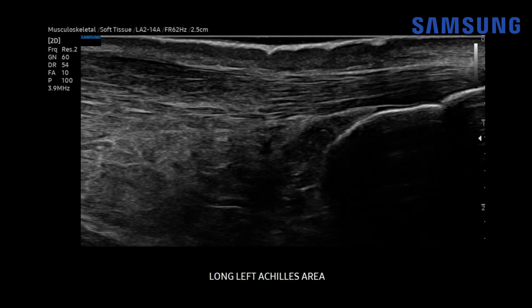Let's start with case one. This was a male in his late 50s with left Achilles pain. We're looking at a longitudinal view of the left Achilles tendon. Patients should be scanned in the prone position with their feet hanging over the edge of the table. Mild dorsiflexion of the ankle and ample scanning gel is helpful to optimize imaging, and you should use a high-frequency transducer of at least 10 megahertz. In this case, we used a 14 megahertz transducer.